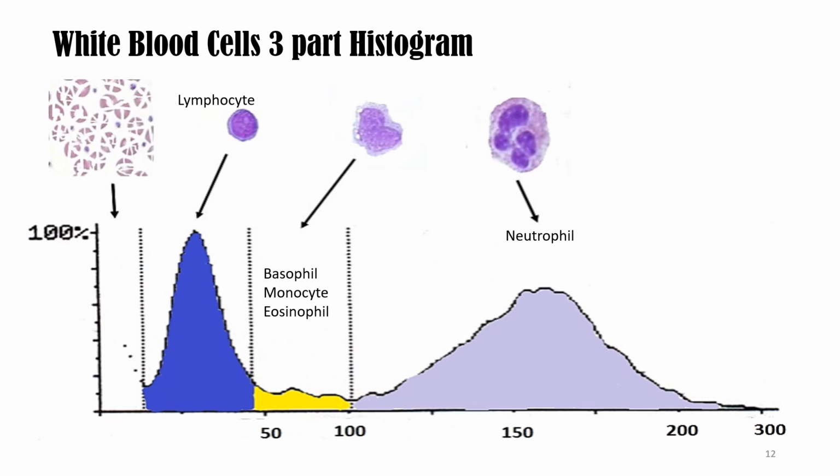Therefore, if the person taking the blood did not follow the proper protocols, by the time the blood gets to the lab technologist, he wasn't there with you when they were taking the blood. He's just going to put it in the machine, and the machine is going to interpret that by size, not that they know how to differentiate between red blood cells, white blood cells, and platelets. And that is one of the reasons why we have so many errors in blood testing.